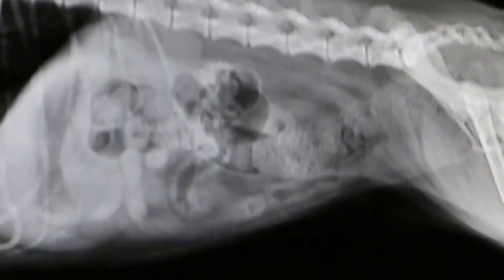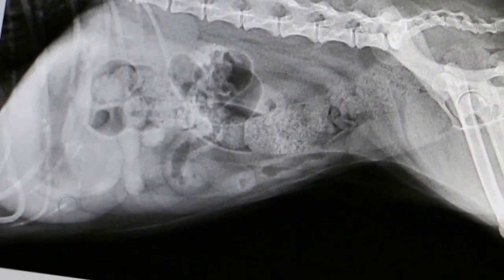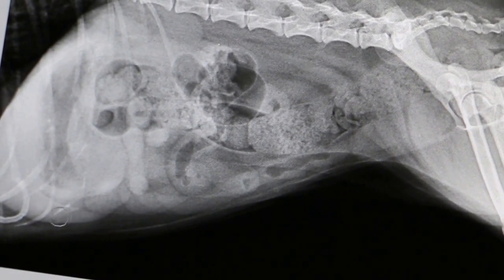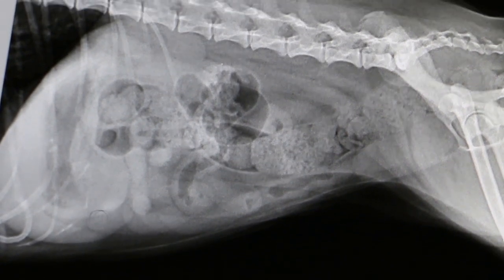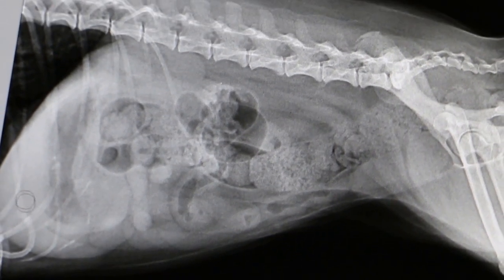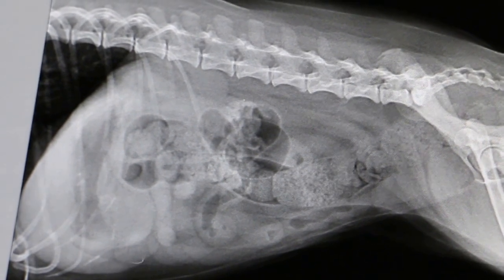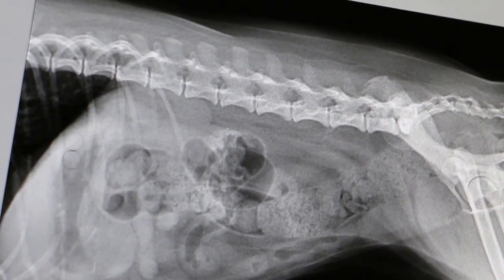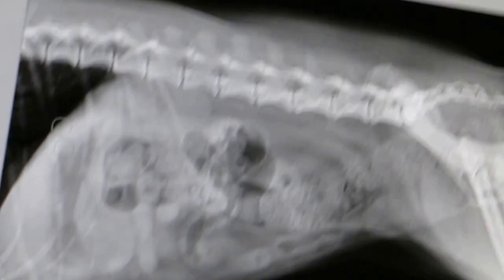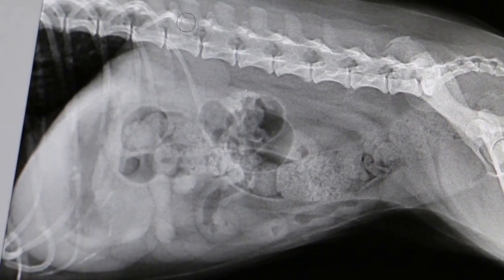Now we go to the third view — the stomach view. You can see the nodules here. And this is the liver — the liver might be enlarged. So we'll wait for the blood test regarding the liver. But overall the pain is always here on the skeleton — on the back, the ribcage.